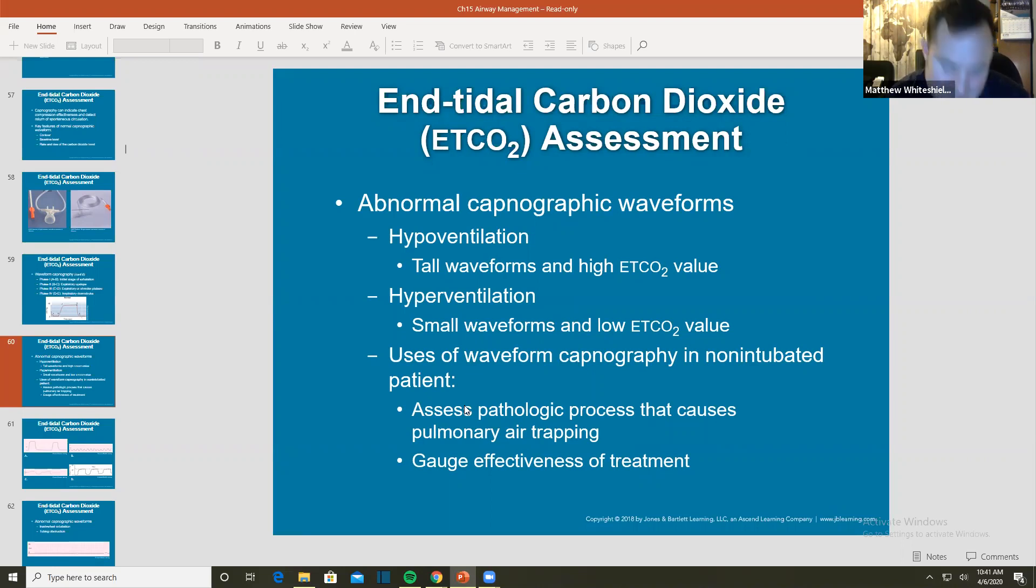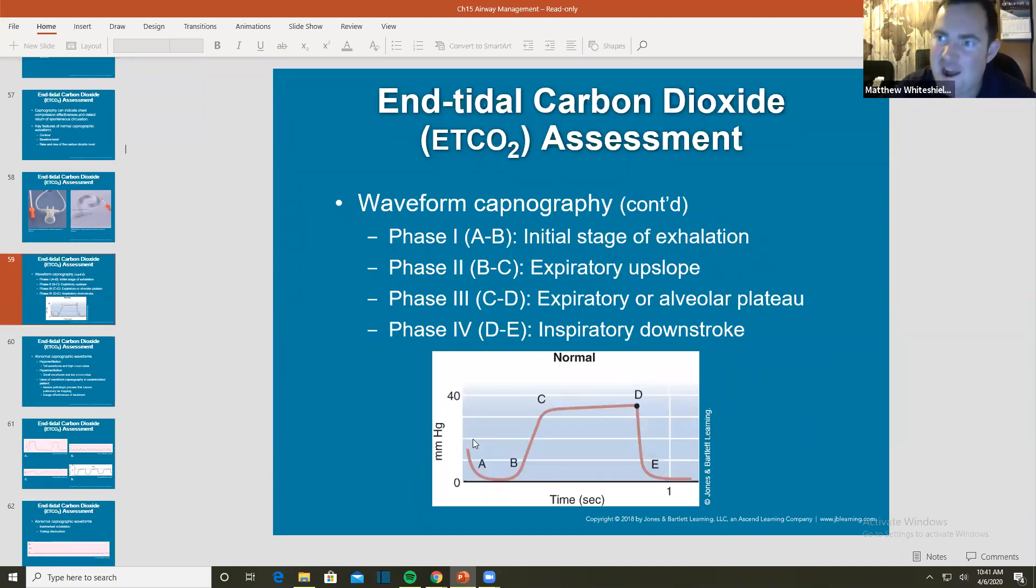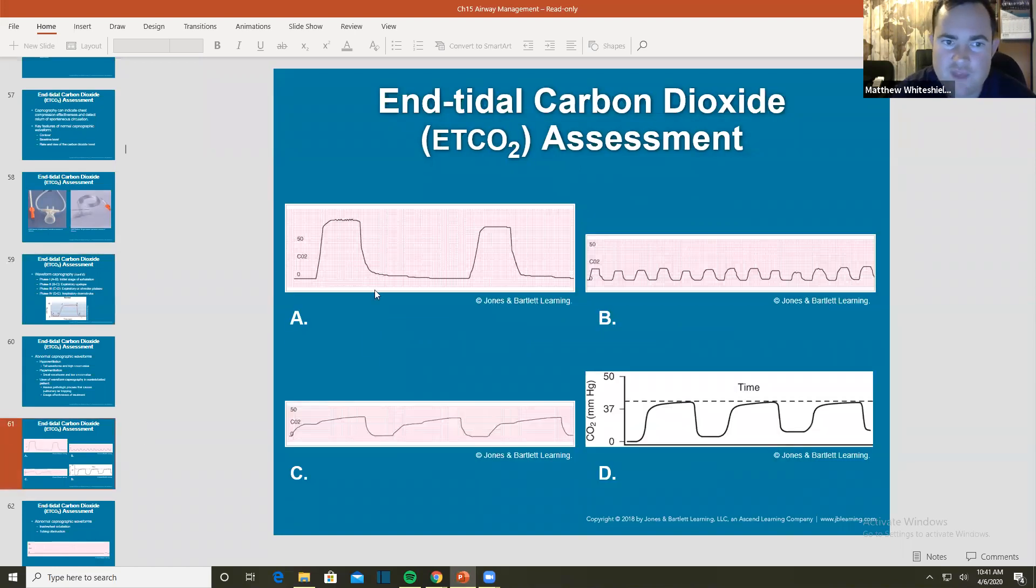Hypoventilation. When I said hypoventilation, not breathing, what happens to your end-tidal capnography or your CO2 readings? They stack. You hold your breath and that carbon dioxide starts stacking in your blood. Going back to this and looking at these numbers, if I have a higher number, what's going to happen to my waveform? It's going to get taller. So I get a taller waveform. Here's 50 right here, it's taller than 50. And you can even see, look at the time difference between this plateau and this plateau.